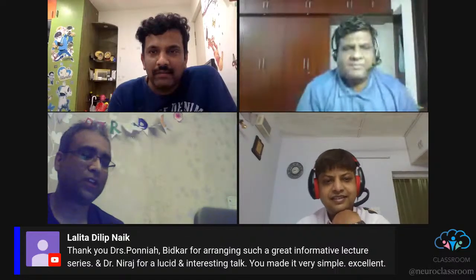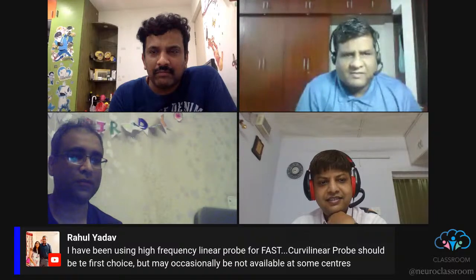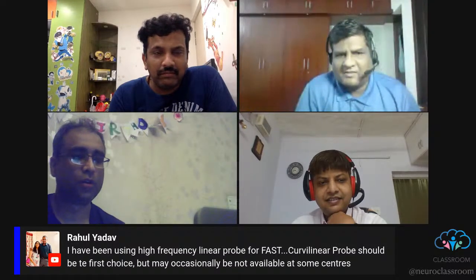This was a very concise and at the same time very extensive coverage of 2D echography and other FAST uses of ultrasound, which is very useful in clinical scenarios, especially in emergency and critical care.